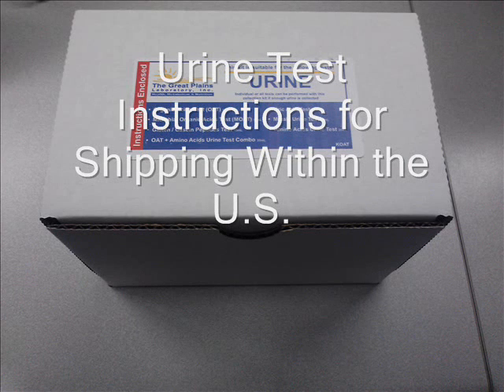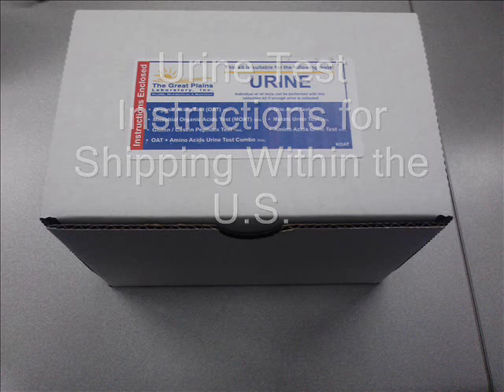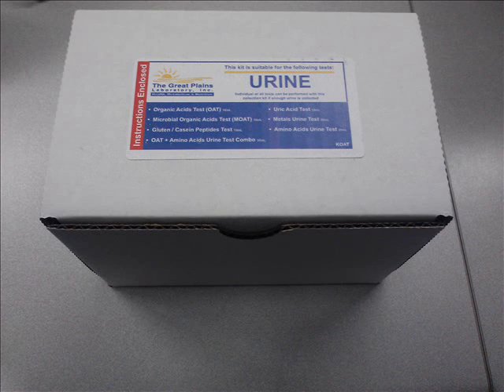Thank you for choosing the Great Plains Laboratory for your testing needs. This video will guide you through the process of how to collect, package, and ship a urine sample to our laboratory from any location within the United States.